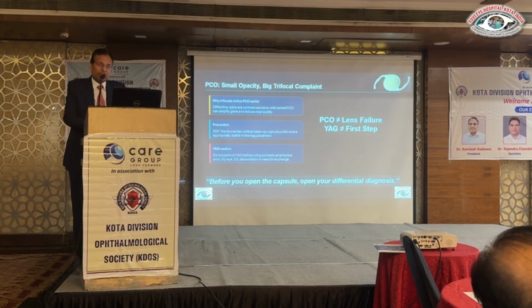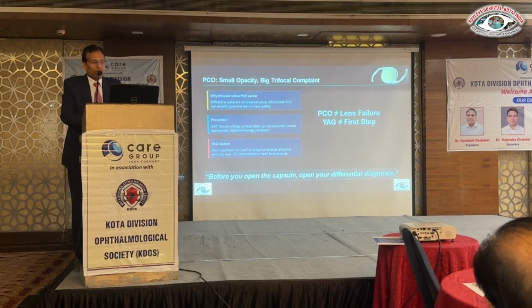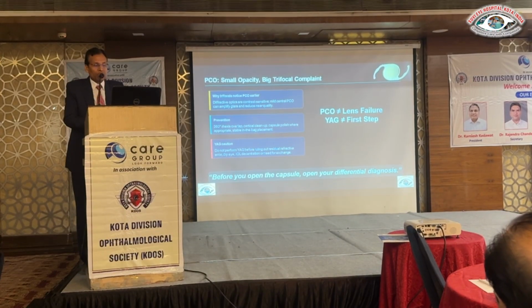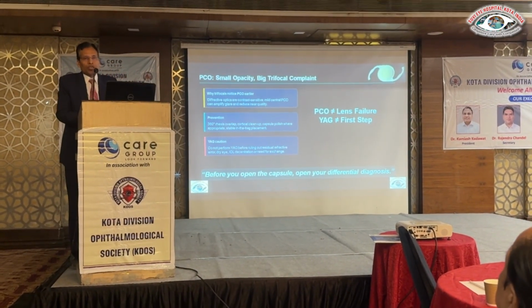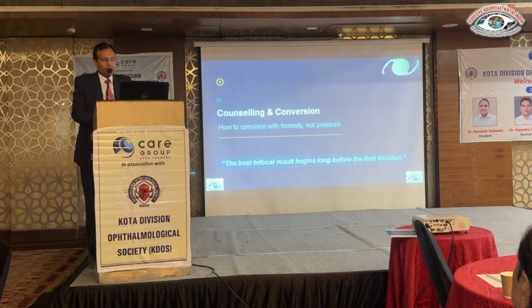Trifocal lenses are more sensitive to PCO, or posterior capsule opacification. So if there is a significant PCO, you can do the YAG laser, but only after ruling out residual refractive error, dry eye, IOL decentration, or need for exchange. So always rule out these factors, because if you require IOL exchange, then don't do the YAG capsulotomy. And counseling is very important.